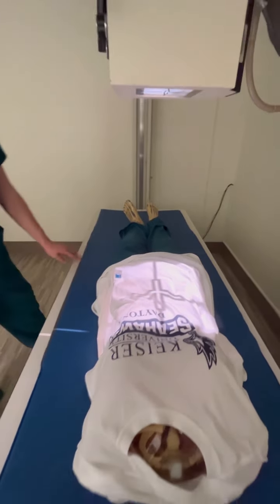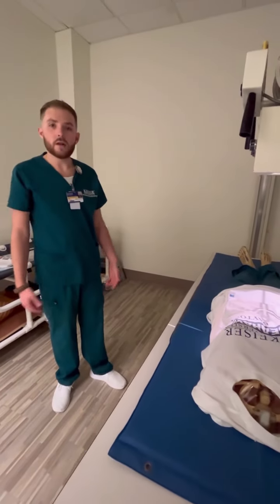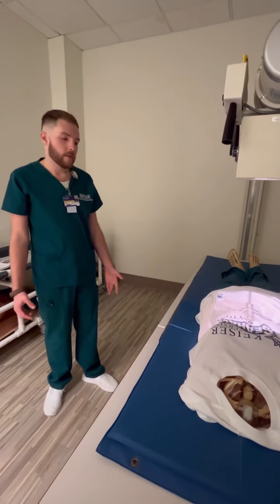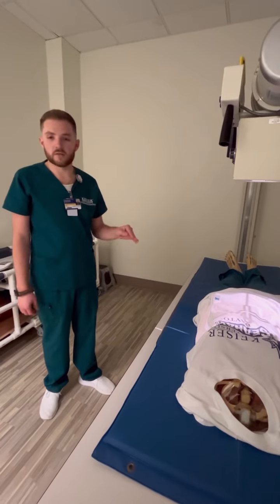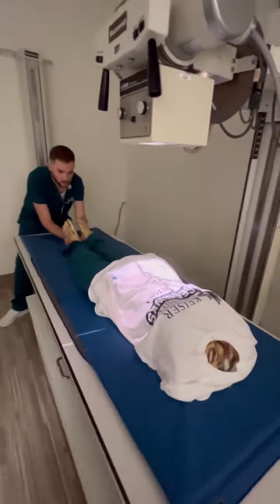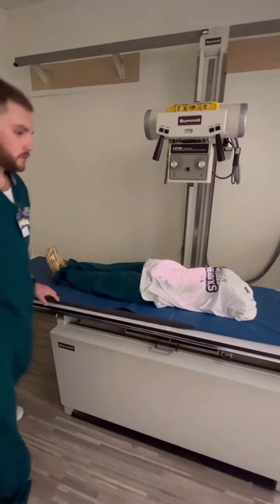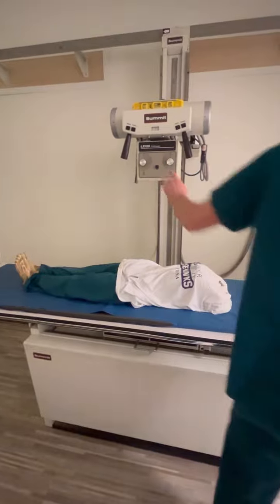So then we would give the patient the breathing instructions. You would tell them to breathe in, breathe it out, and then hold it out. And as they hold it out, that's when you want to make your shot. I'm just going to make sure my patient is centered. Make sure it looks pretty good to me. Okay, let's go on ahead and do this thing.